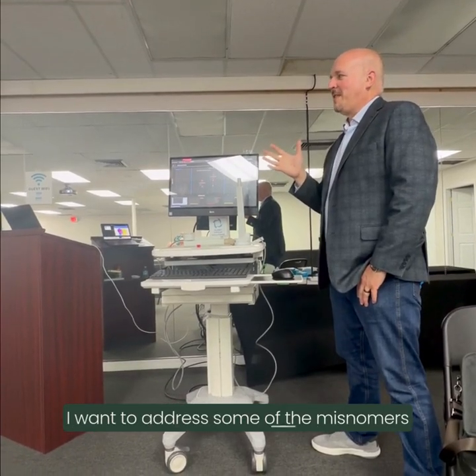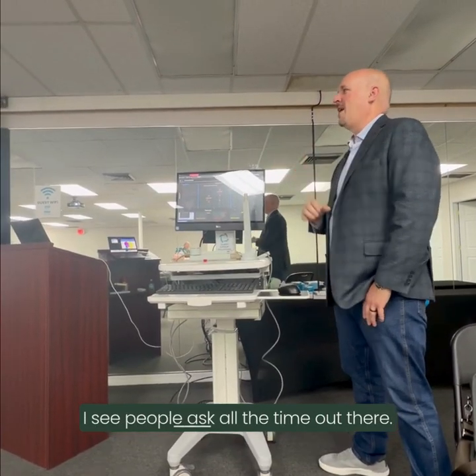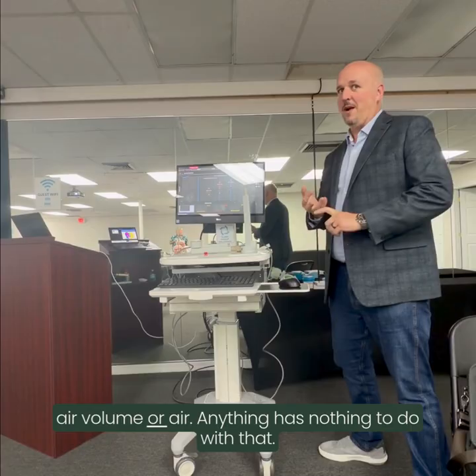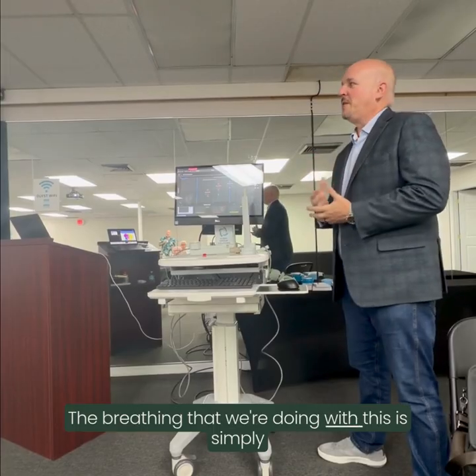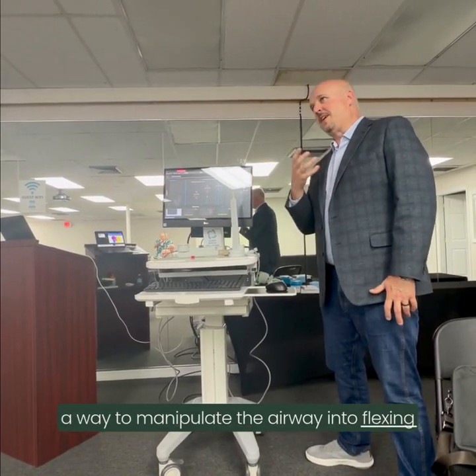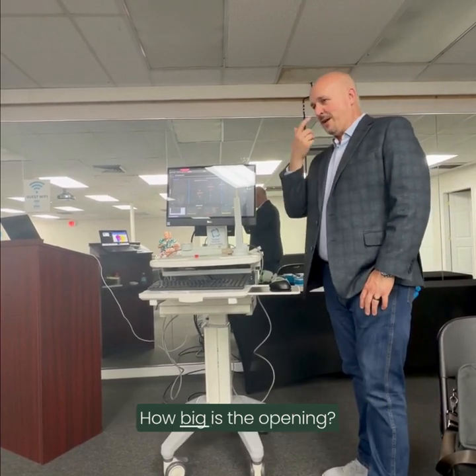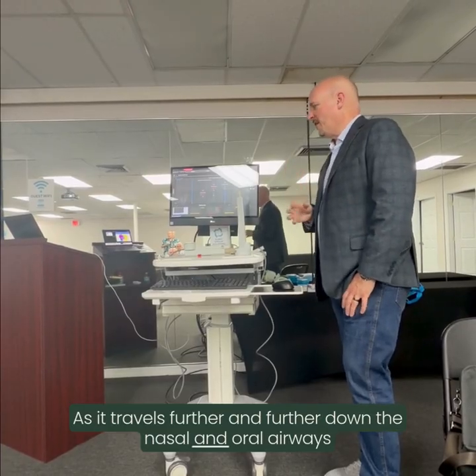I want to address some of the misnomers and some of the myths and some of the questions I see people ask all the time out there. But the first thing is it's not measuring airflow or air volume or air anything. It has nothing to do with that. The breathing that we're doing with this is simply a way to manipulate the airway into flexing and changing and doing what we want it to do, but it's not measuring anything as far as flow. It's strictly size. How big is the opening as it travels further and further down the nasal and oral airways.